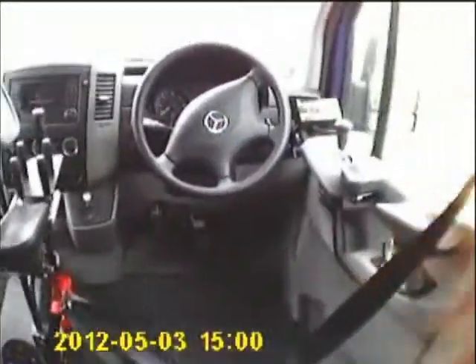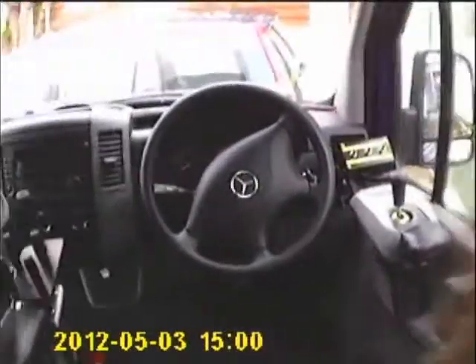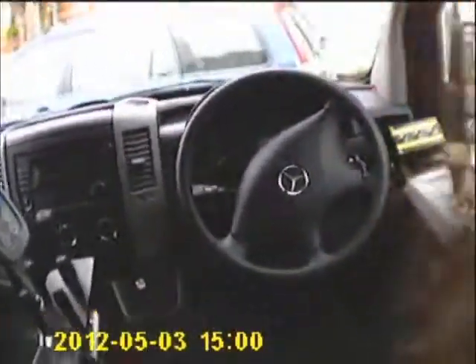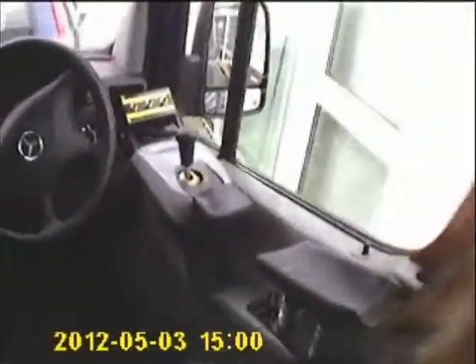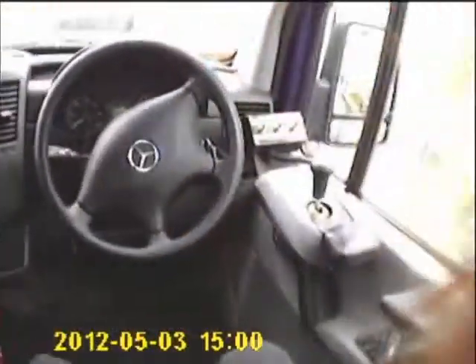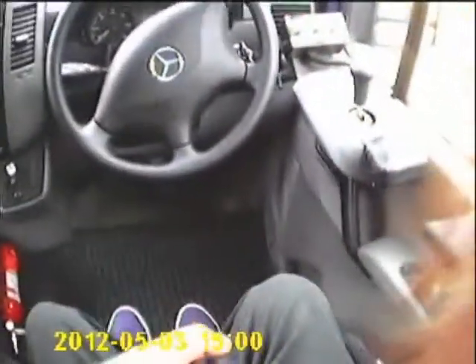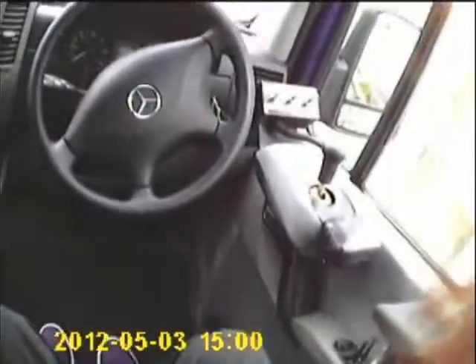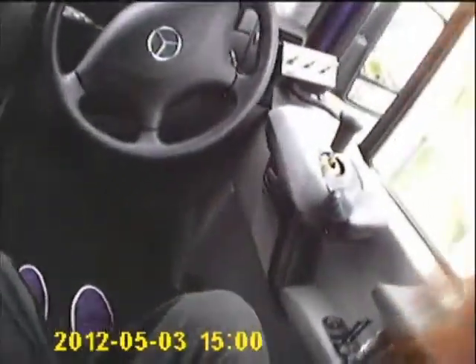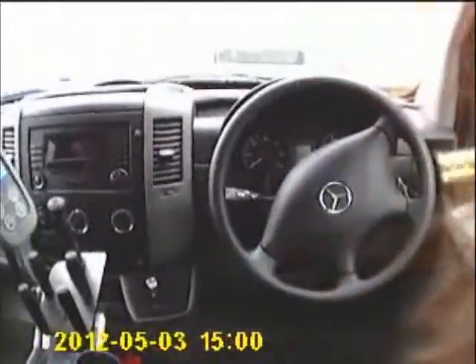We've got to manoeuvre our way in and get the seat belt in the right place. This is always a bit of a pain — getting the seat belt and the top positioned correctly.